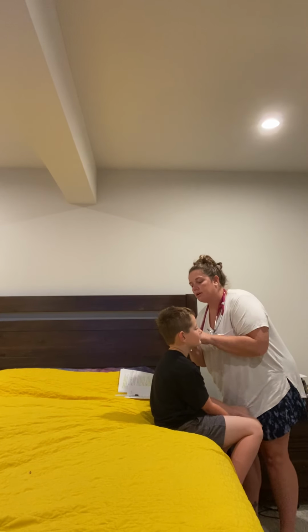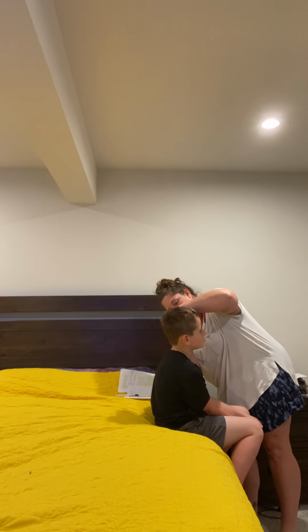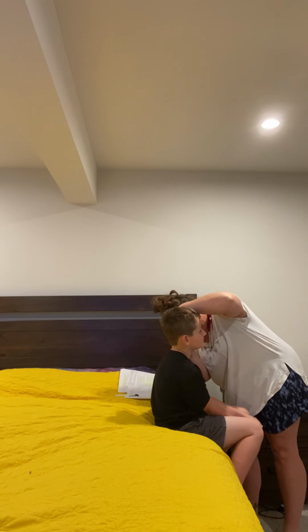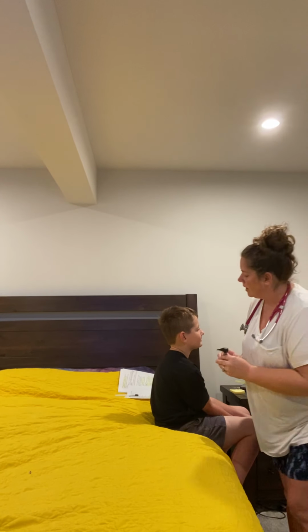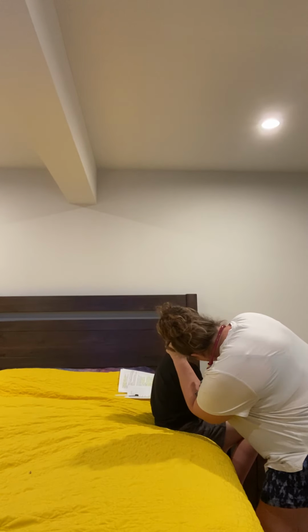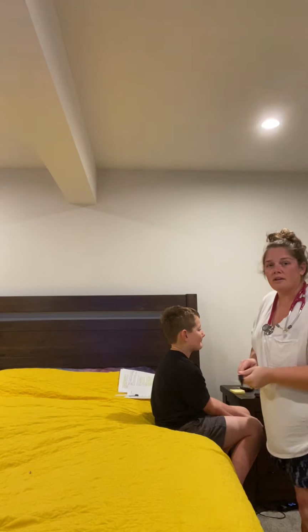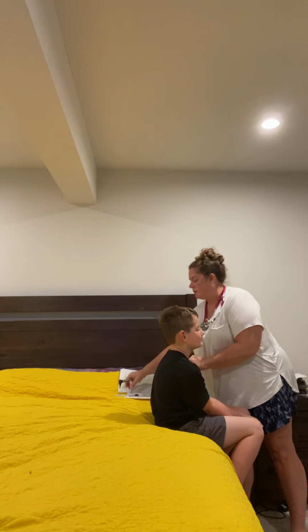So I'm going to pull the earlobe back and maybe down and up a little bit and look into his ear. I'm looking for those landmarks and any erythema, any bulging. And his ears are negative for any bulging, any redness, any drainage.